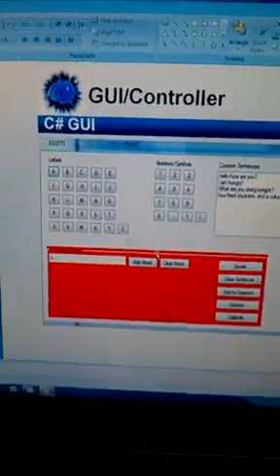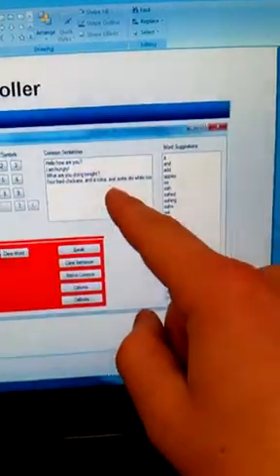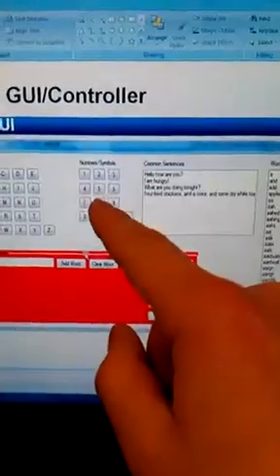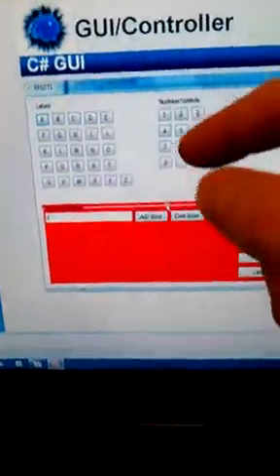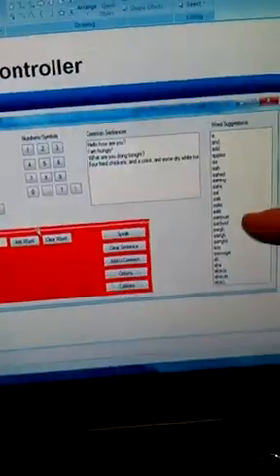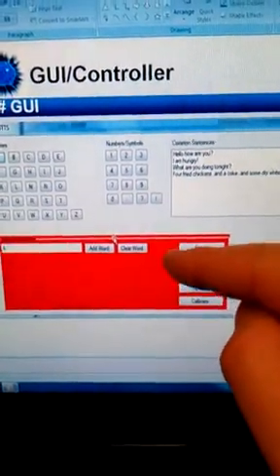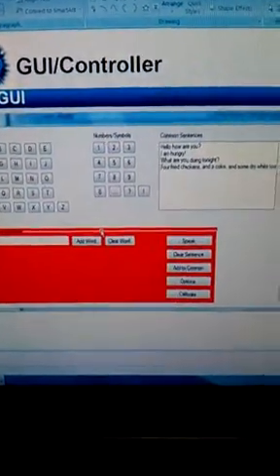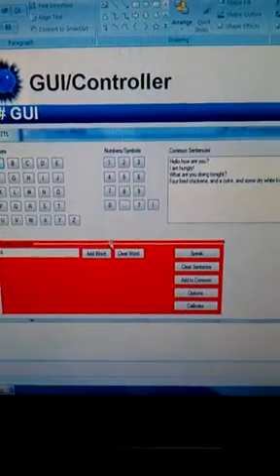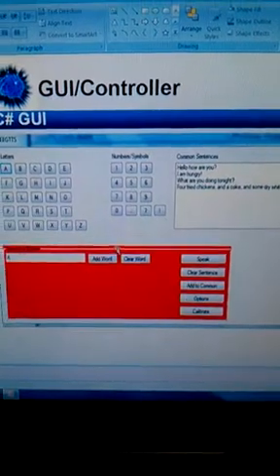like. There's a bunch of different options you can choose. Each one of these options here, so there's letters, numbers, common sentences, word suggestions, and a sentence builder. So each section will be highlighted, and the user will just basically look at one of the sections, and then it's flashed. Each option is flashed 5 times. We average the signals that are acquired after each stimulus and find out where an ERP existed.